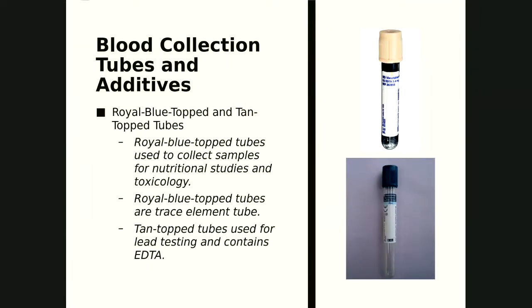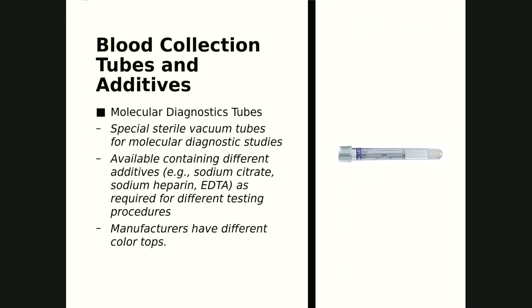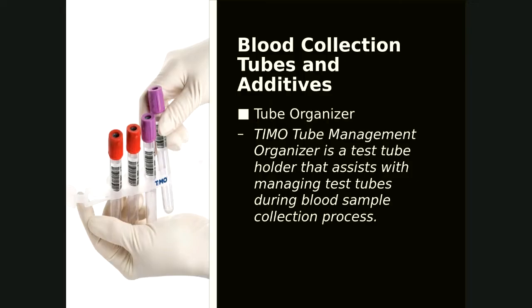Just an FYI, the royal blue top tube also comes as a serum tube, so we need to be really careful about reading the label to make sure we have the correct anticoagulant present. Molecular diagnostic tubes are special sterile vacuum tubes for molecular diagnostic studies, available containing different additives, such as sodium citrate, sodium heparin, and EDTA, required for different testing procedures. Manufacturers have different color tops.